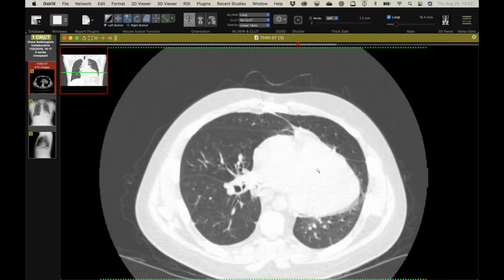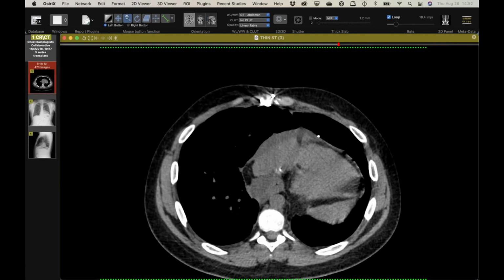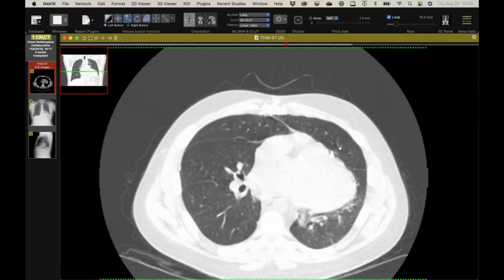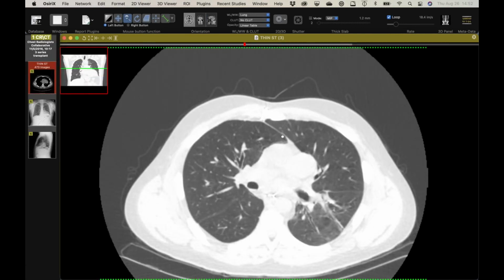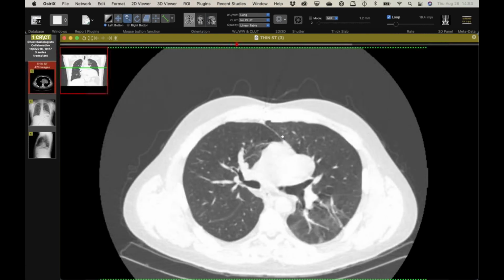And I'm not sure, I presume there's some missing pericardium in here. You can see, you don't really see much of it. There's a little bit down here, but not really. So it's just kind of floating out there in this funny orientation. But this is both donor heart and donor lungs. So it's a tracheal anastomosis right there, and then the vascular connections.